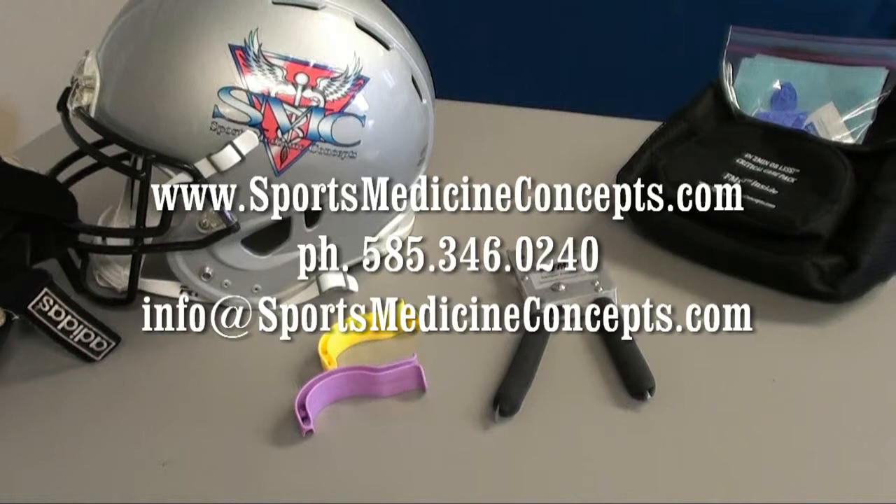This concludes our discussion on using the FM Extractor to cut the shock blocker face mask fastener. Should you have any questions, please do not hesitate to call on Sports Medicine Concepts.